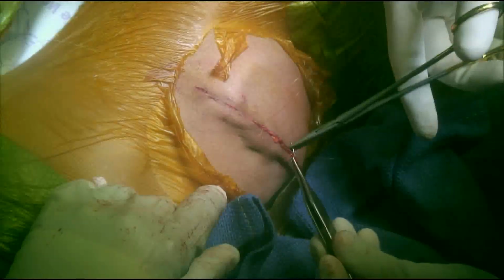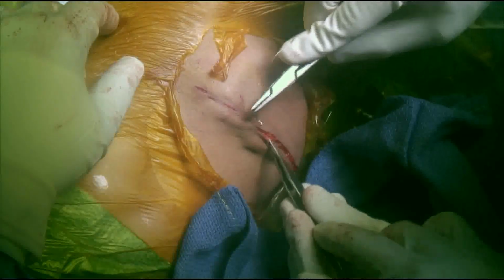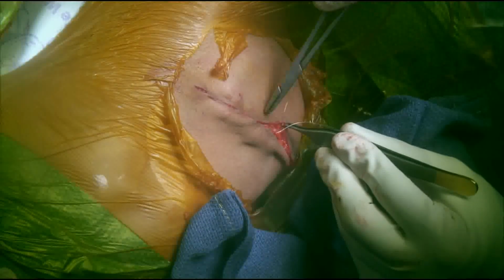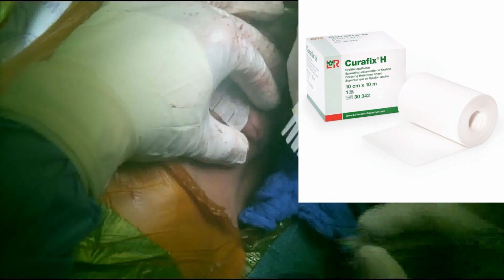The wounds can be closed in layers using absorbable sutures. Some surgeons prefer to close it using a mattress suture. It is the surgeon's preference that determines the closure, but make sure it is watertight. After completion of closure, a standard dressing can be used initially and then reinforced by a pressure dressing like Curafix in order to decrease the rate of seroma and other wound complications.